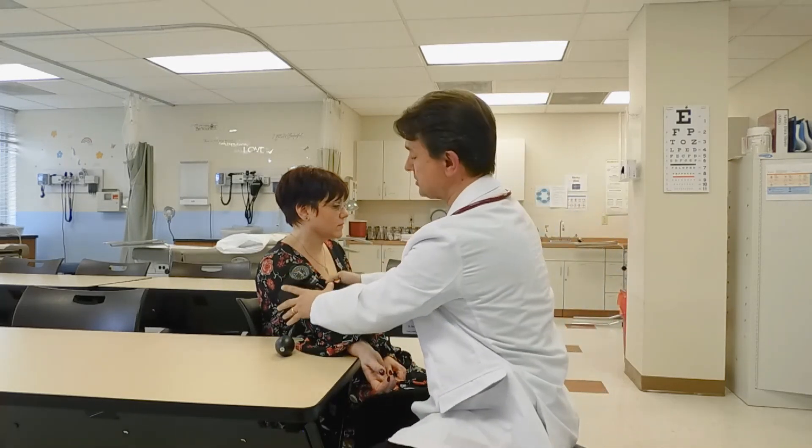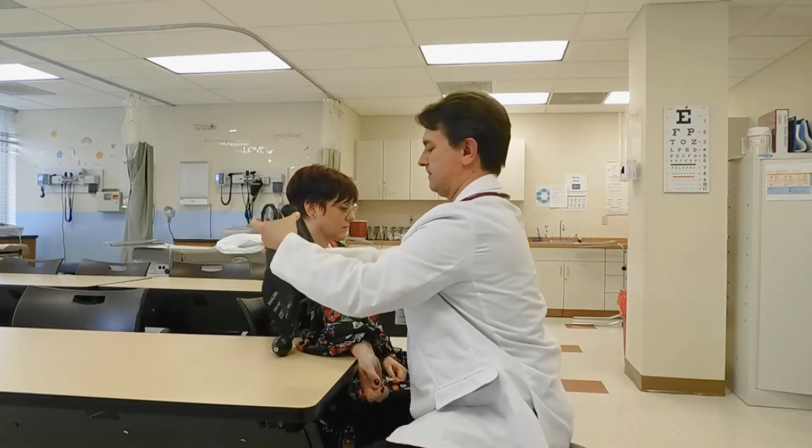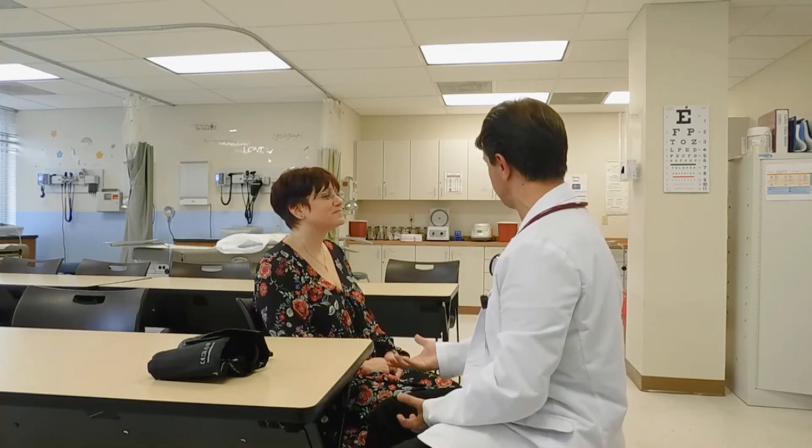Remove the cuff from your patient and make sure it is fully deflated. At this point you would document the patient's blood pressure correctly in either your digital or manual charting system and compare it against previous readings. Don't forget to thank your patient for participating in the procedure. Thank you so much for your blood pressure reading — we're going to record that and give these results to your provider, who will be in with you shortly.